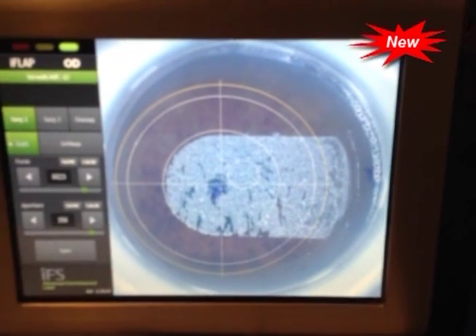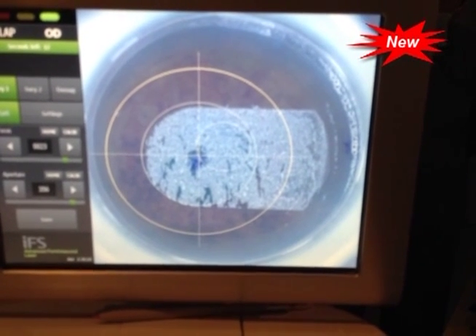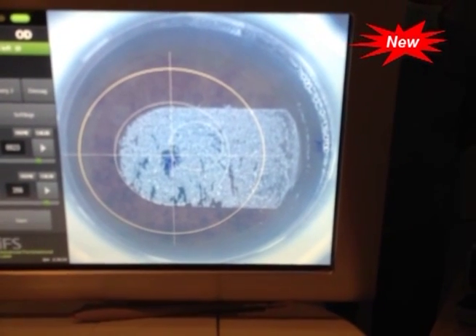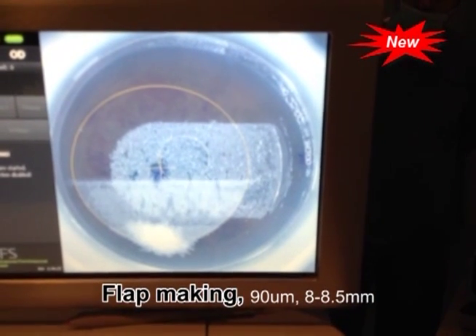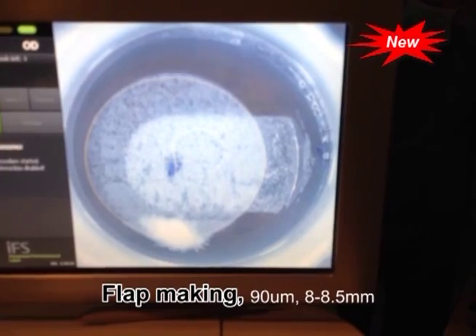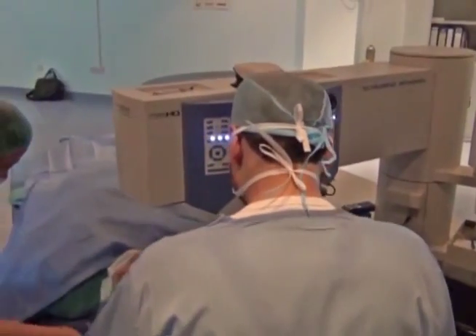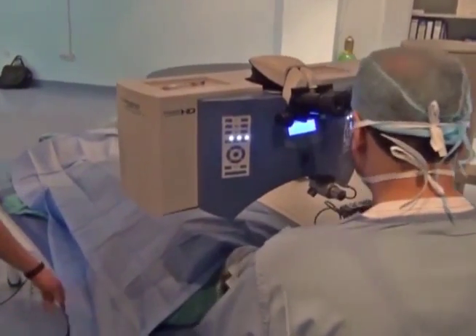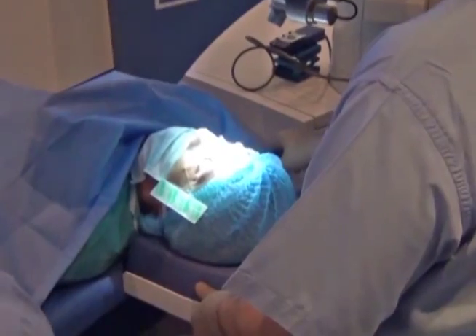We shift the flap to put it exactly on the same area, so we have one reference point for both procedures. We make a 90-micron, 8 to 8.5-millimeter flap centered around the marked area. Then we move the patient from the femtosecond machine to the excimer laser machine.